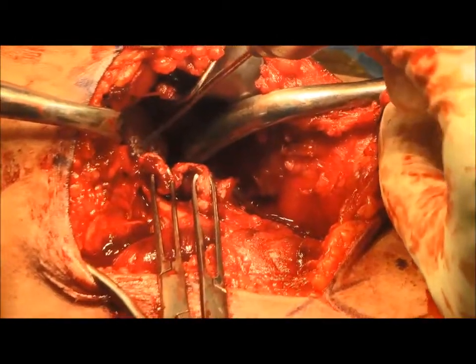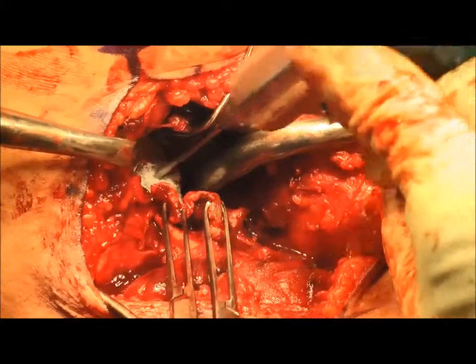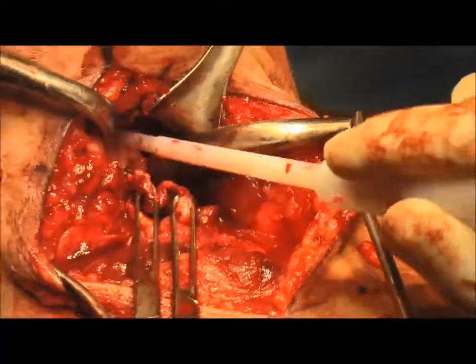Next, we plan for the placement of two cortical buttons. The drill pin is used to place two holes approximately 10 to 15 millimeters apart, preferably at a slight angle to the flat cortex. The bone debris is then irrigated.